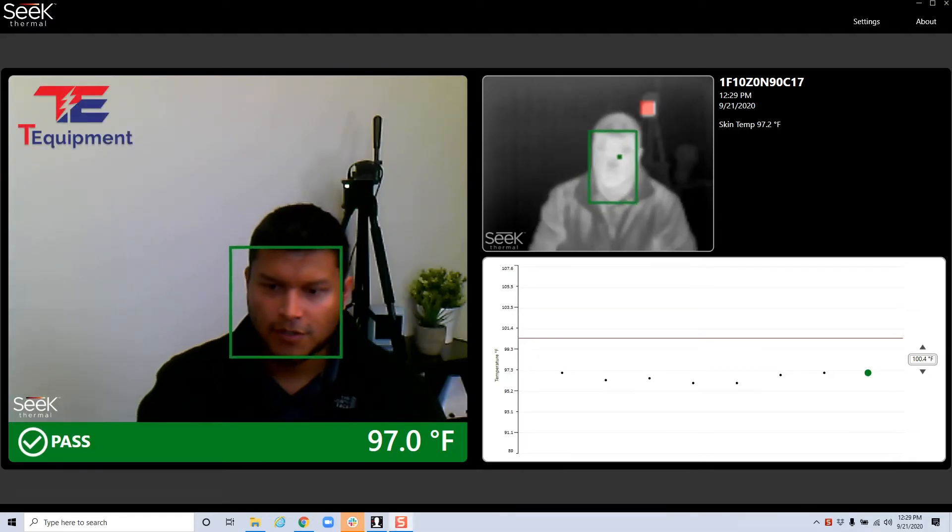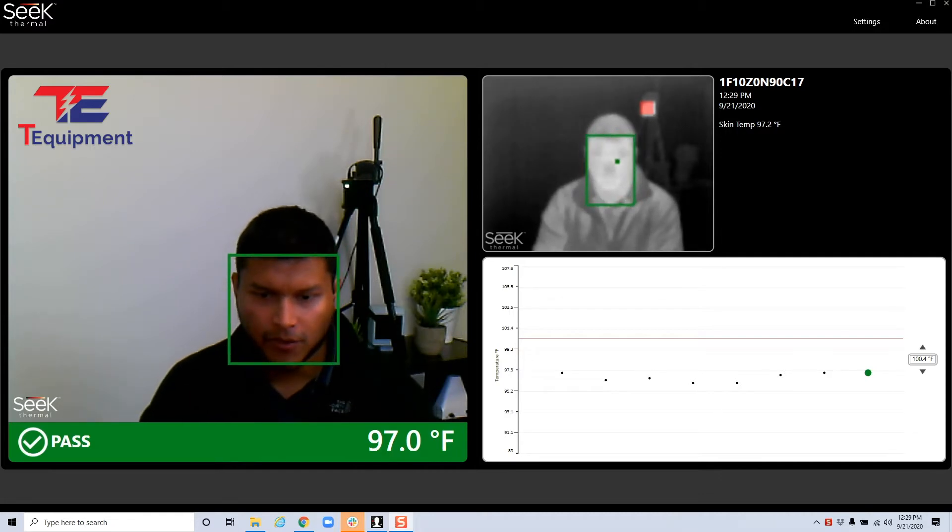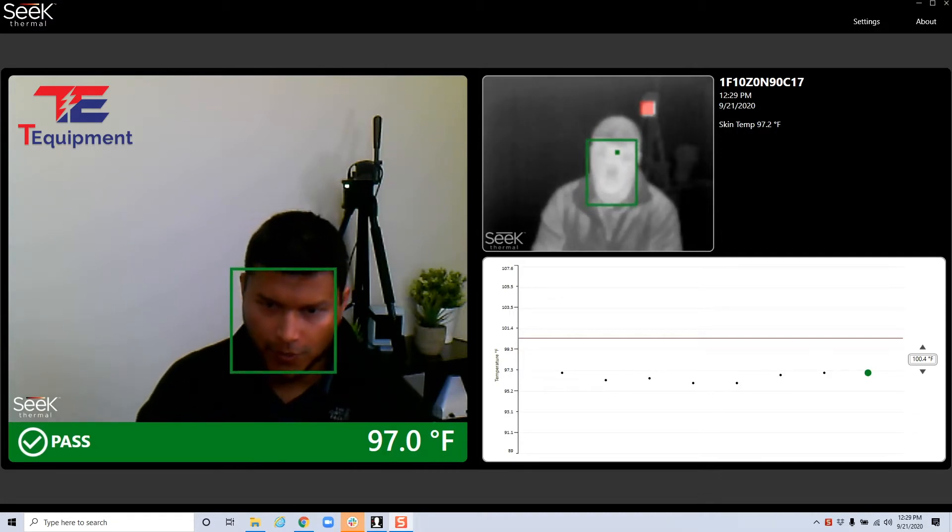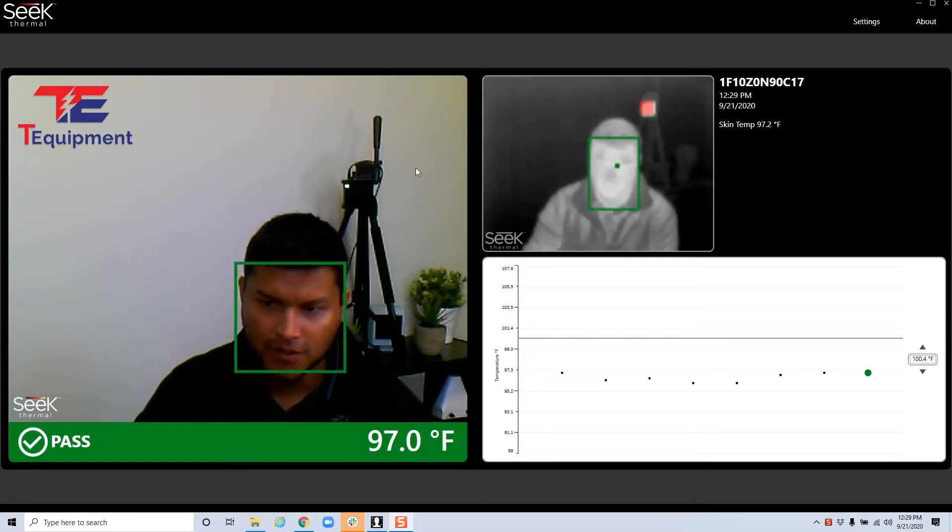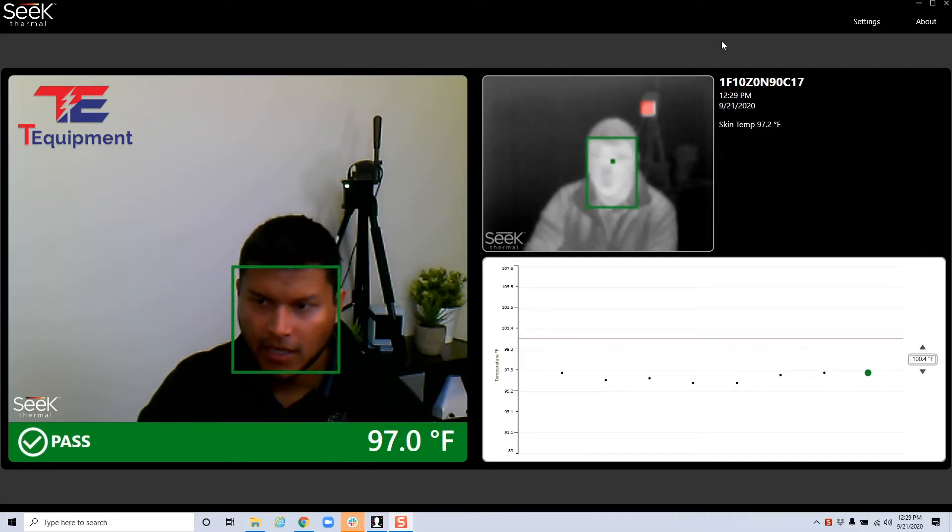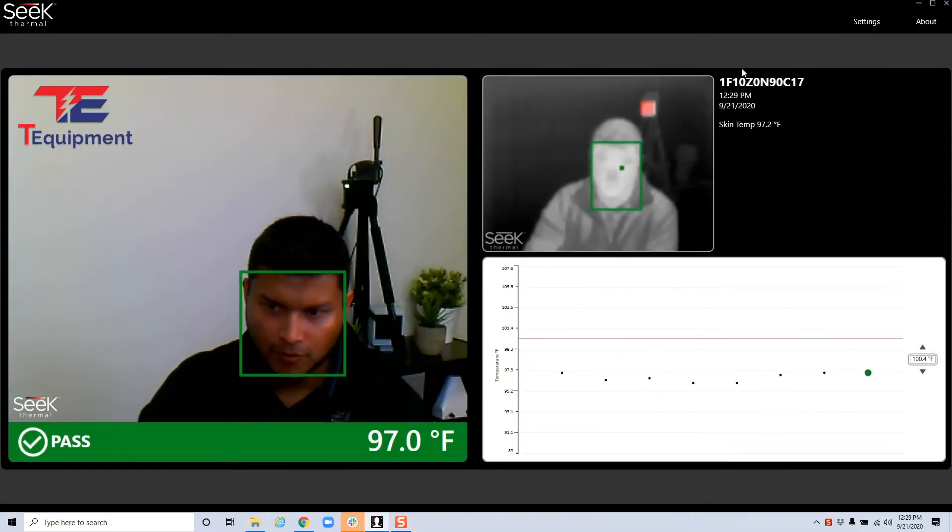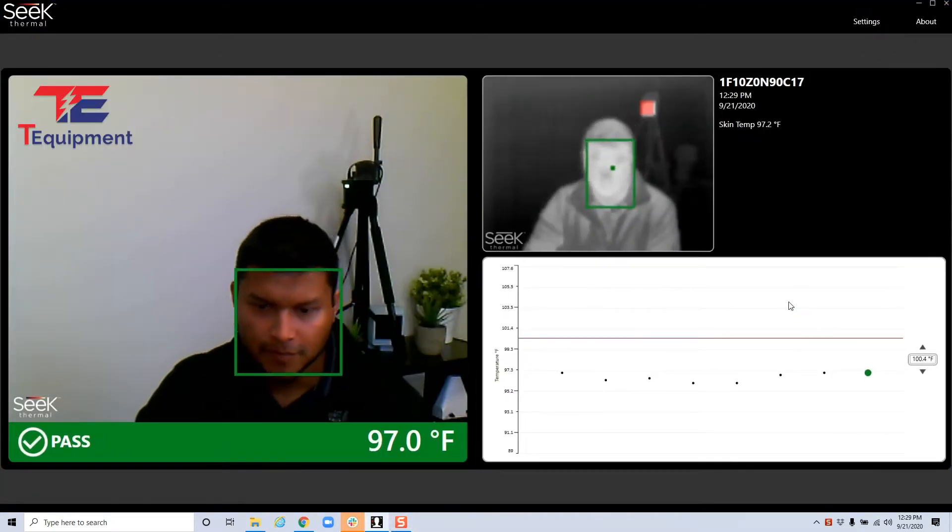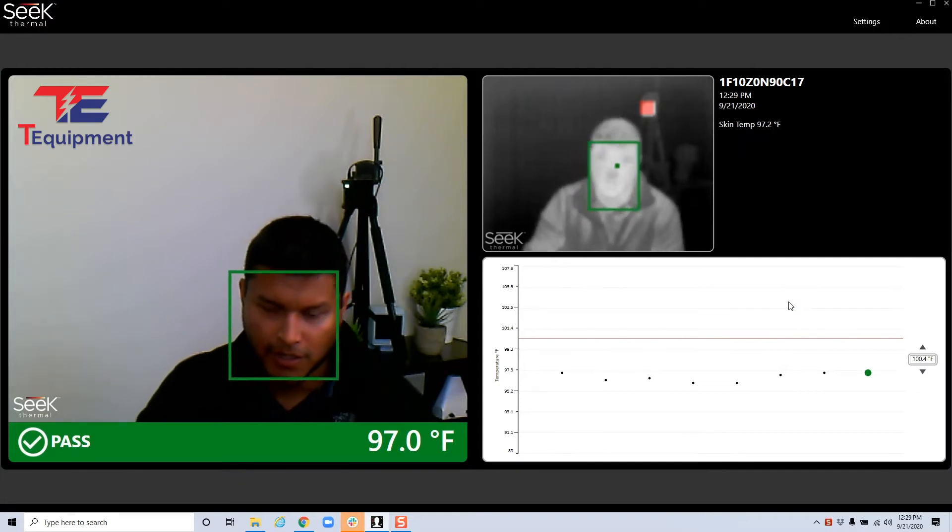All right, in this video we're going to talk about the new Seqscan thermal software. It's been updated as you can see, it doesn't look like the other one. You will also notice that I am now full screen, that's something new, the other one couldn't do it in the past.